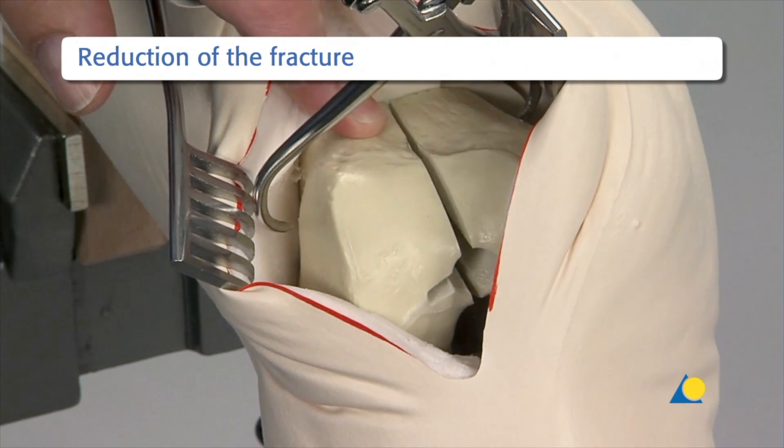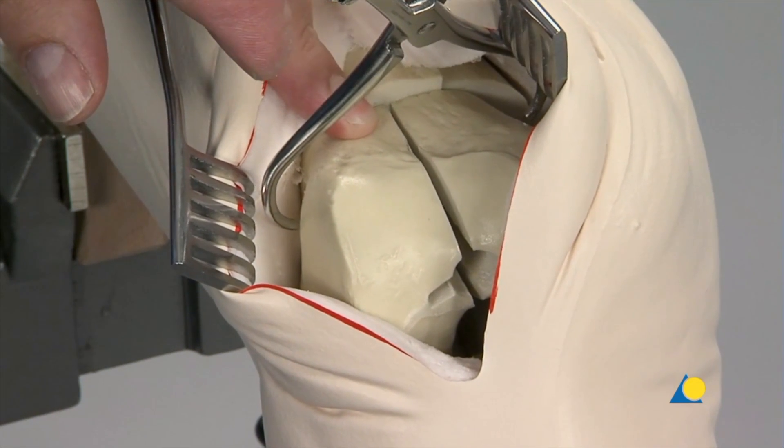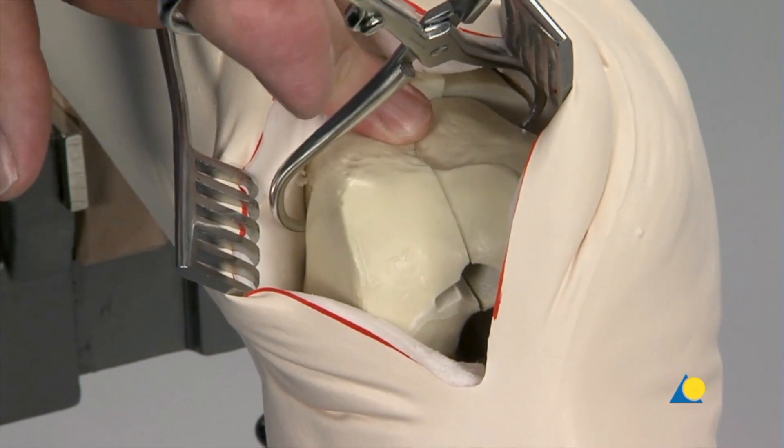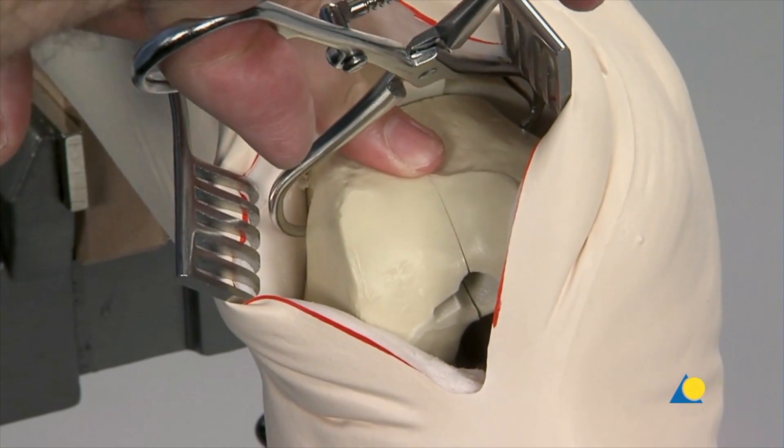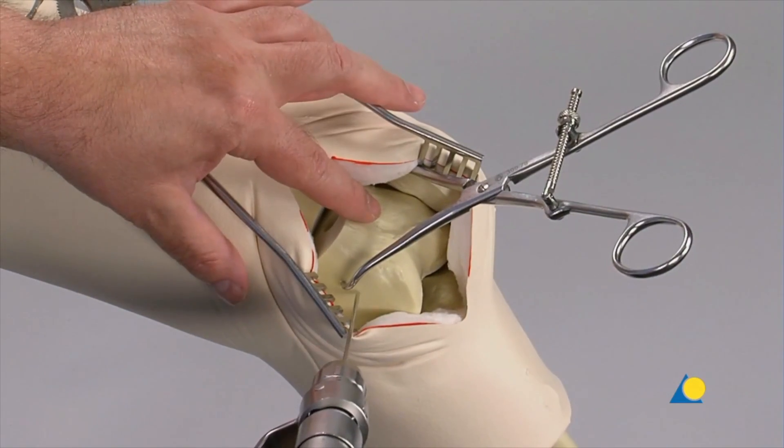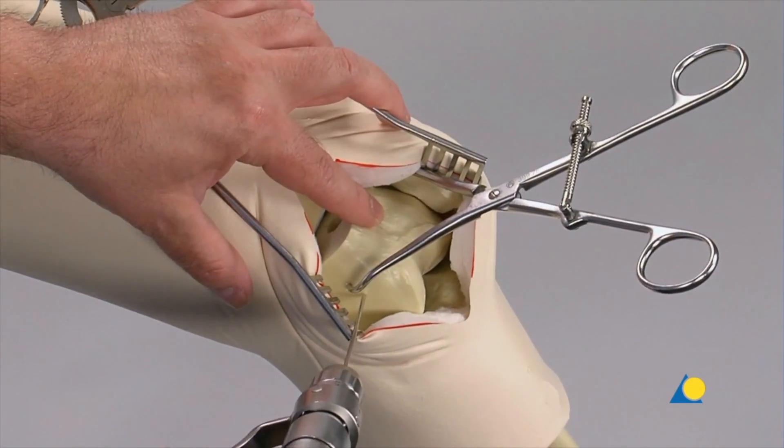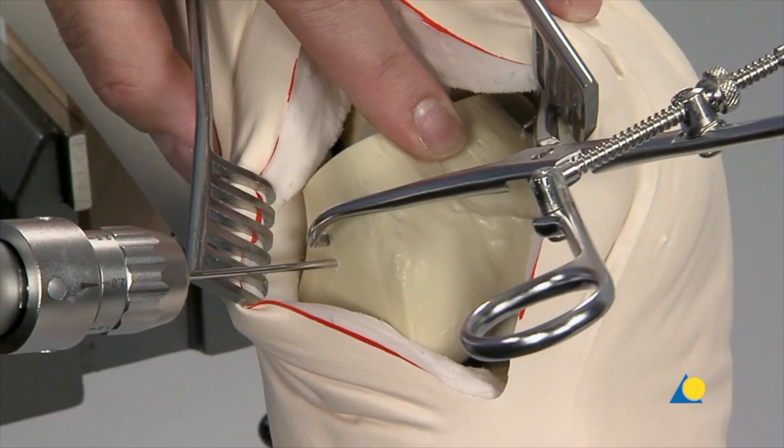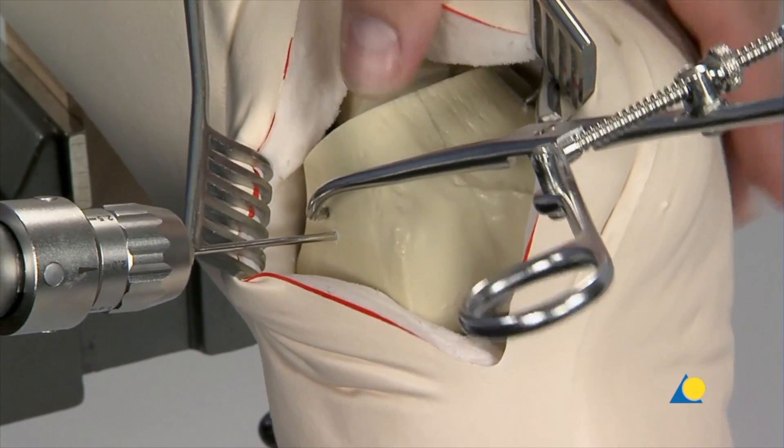The large pointed reduction forceps is used to reduce the joint block. The reduction of the joint block is first secured with two centrally placed K-wires. It is important to use two K-wires to ensure rotational stability.